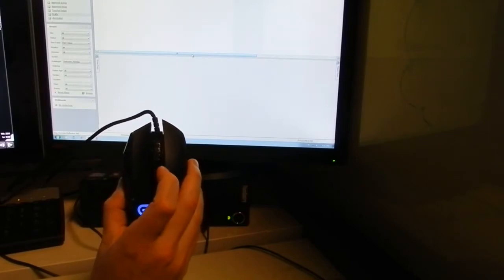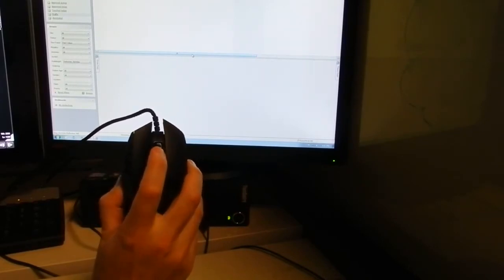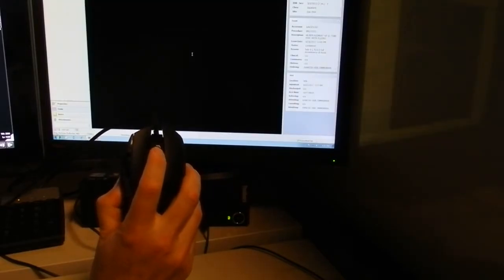The first function to learn is pressing straight down on the middle mouse button. That is F2, which brings the study over to PowerScribe to be read.